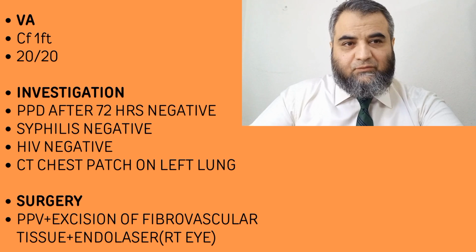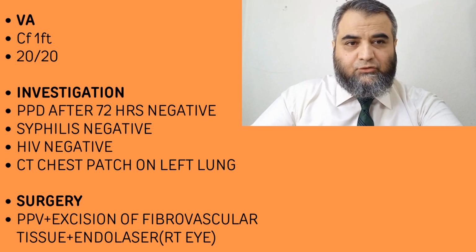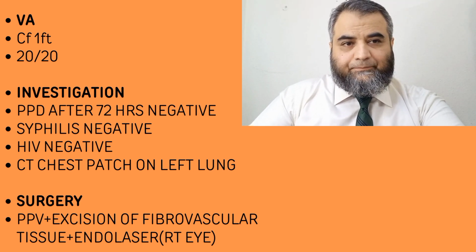Endo laser was done, indirect was also used, and after that, even in the left eye, which is the ischemic one, scatter lasers were done on the ischemic areas.